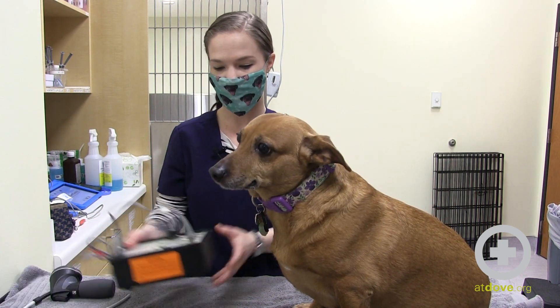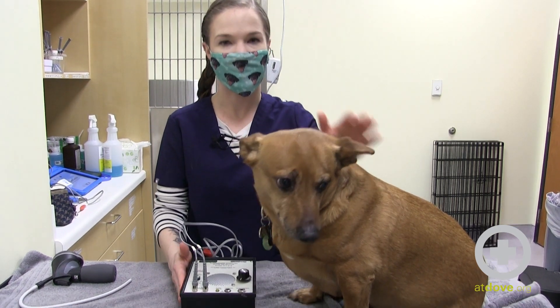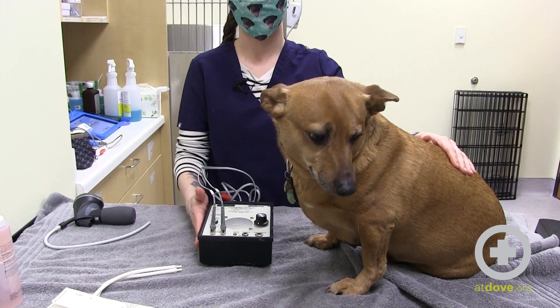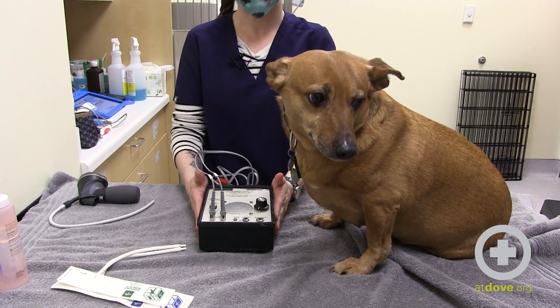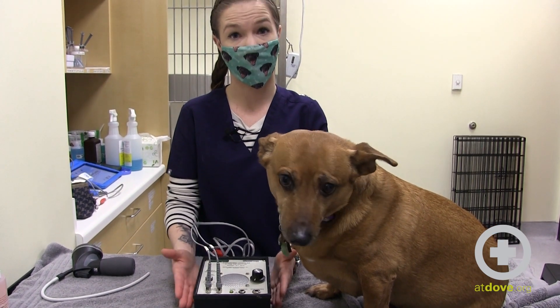Today we're going to troubleshoot Doppler. A Doppler is something we use to read blood pressure, but it can actually be pretty finicky, especially just learning how to use it. So we're going to troubleshoot some of the common errors or issues that we have when trying to get blood pressure using one of these. The first thing a lot of people have trouble with is just not being able to find the pressure from the vessel at all.